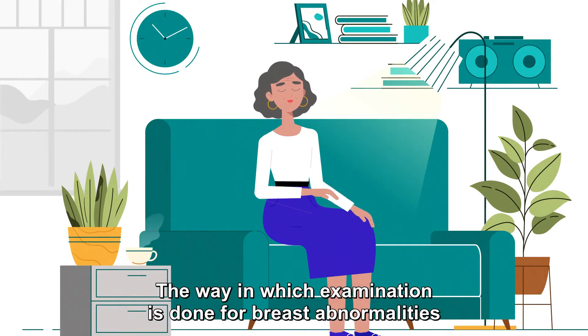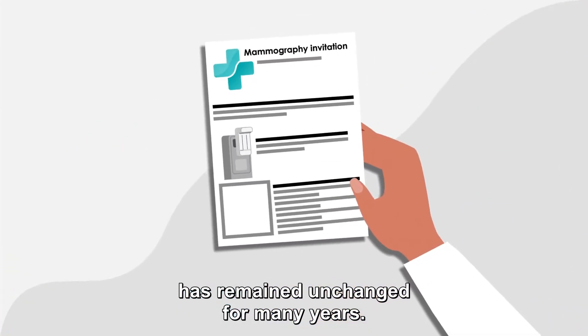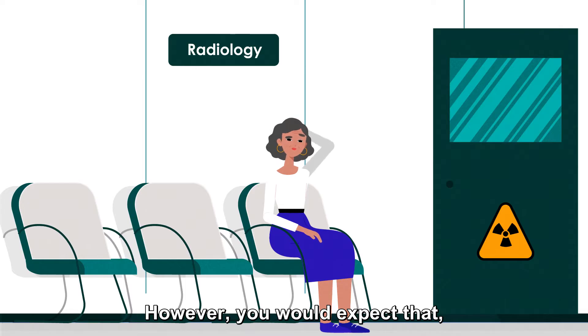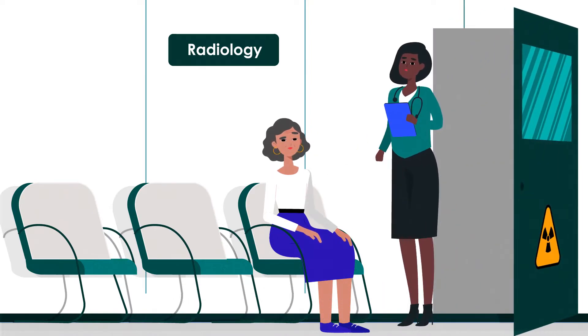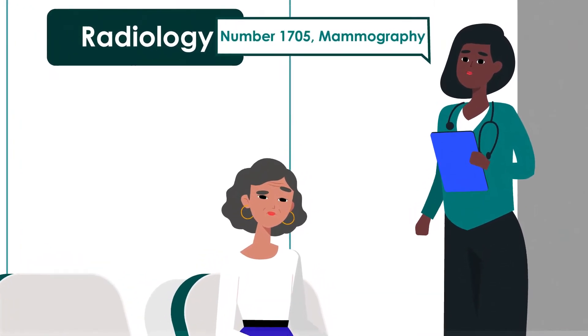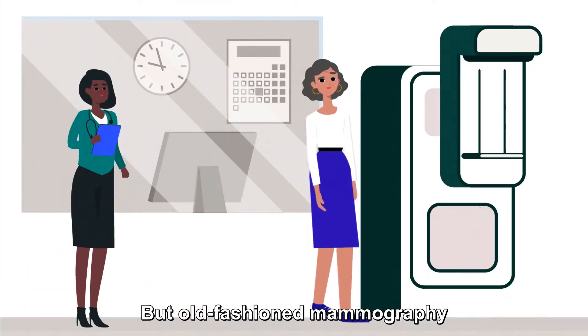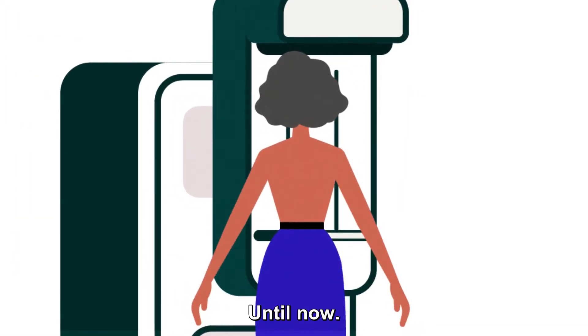The way in which examination is done for breast abnormalities has remained unchanged for many years. However, you would expect that, with technological advancements over the past few decades, this exam would be significantly less stressful for women. But old-fashioned mammography is still the most commonly used method. Until now.